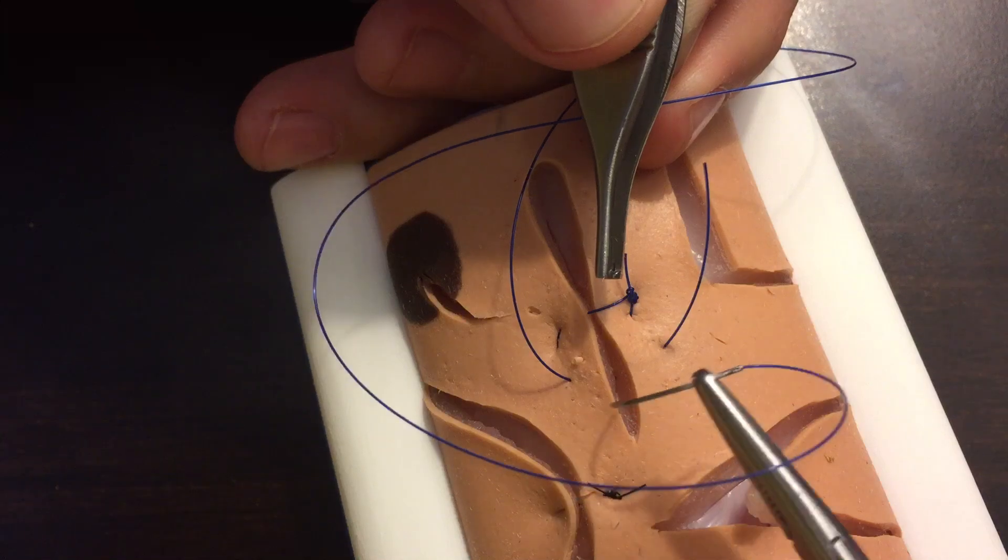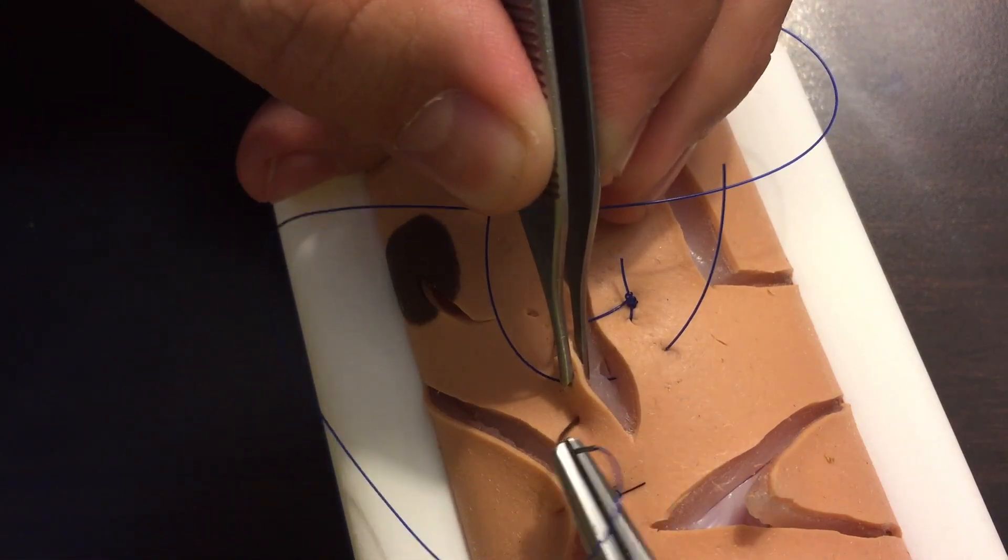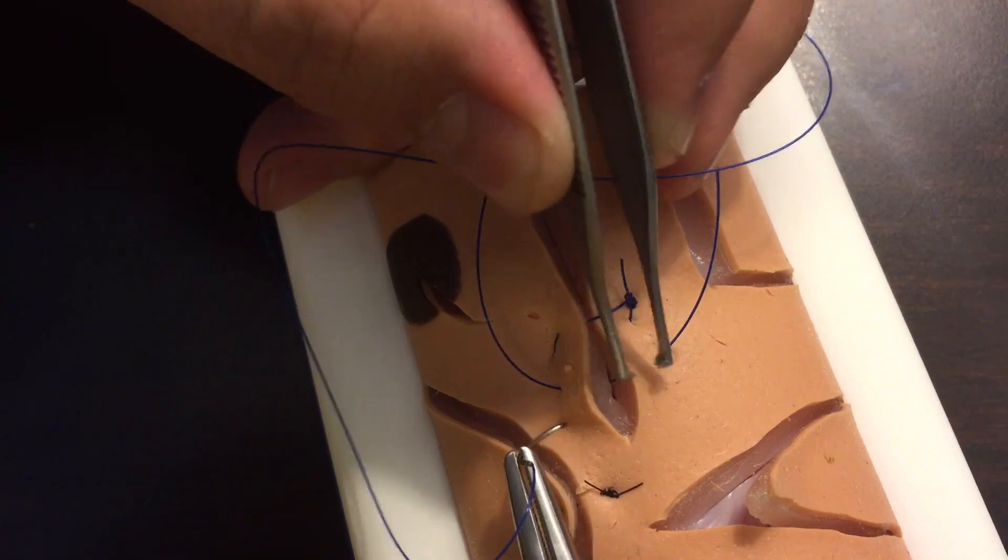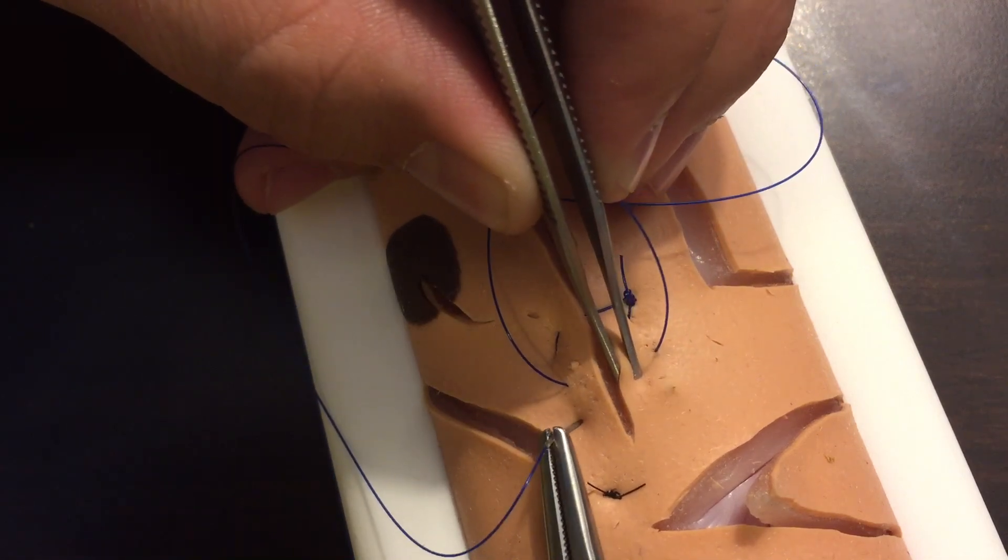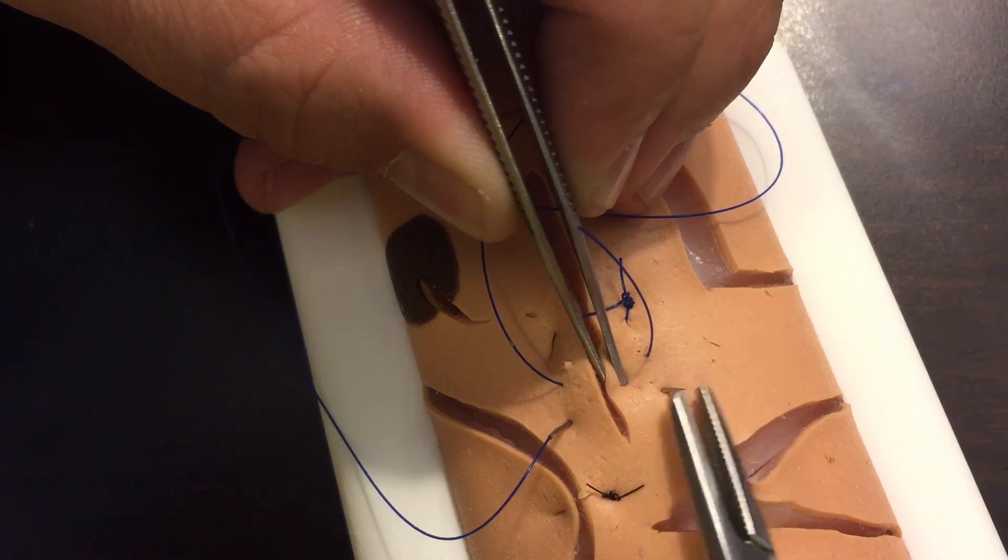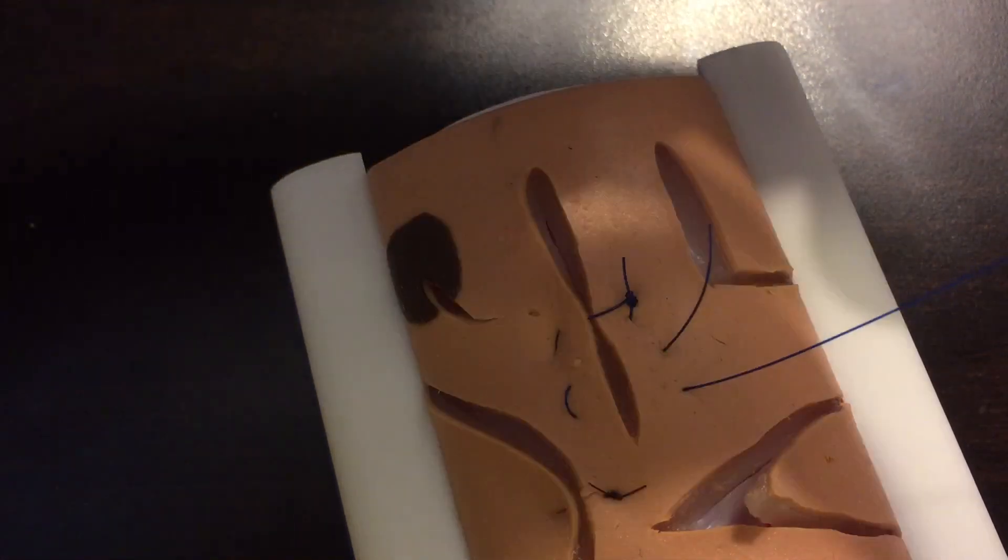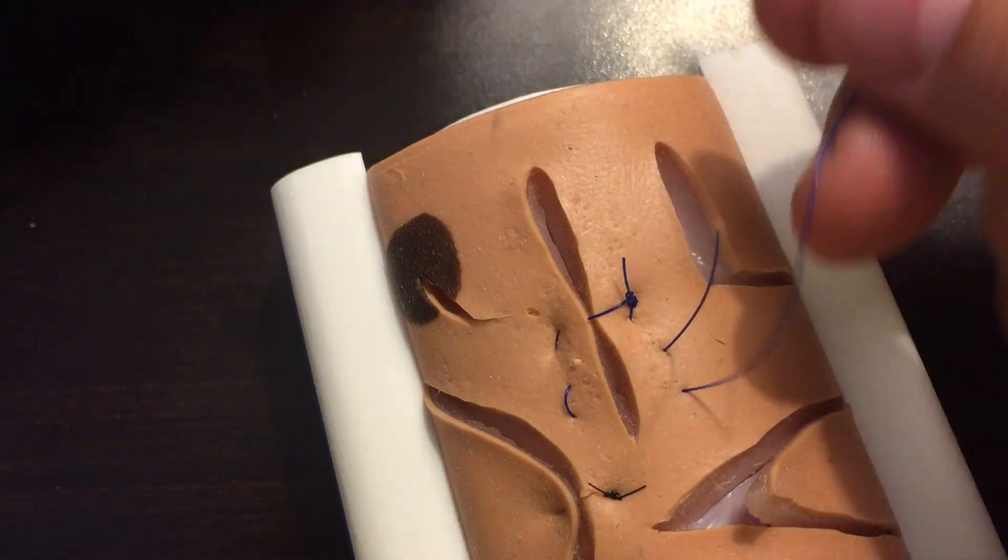Again, staying the same distance from the skin edge, we're going to enter the skin, coming across at that same depth that we did the first pass, and then exiting the skin at 90 degrees, the same distance as we had first entered the first time.